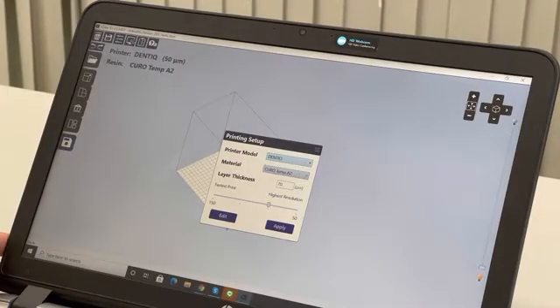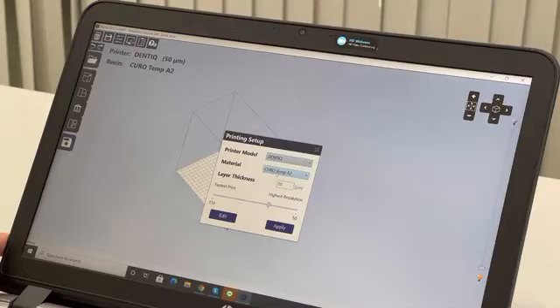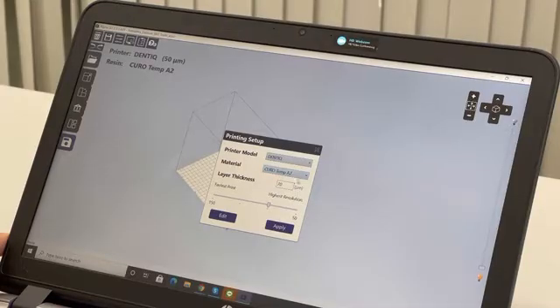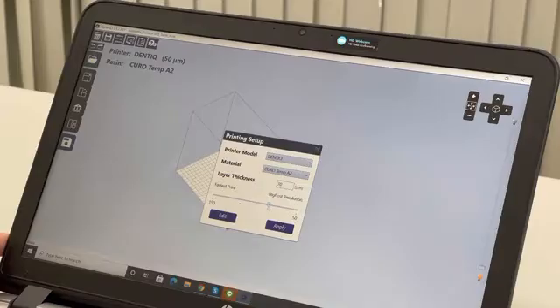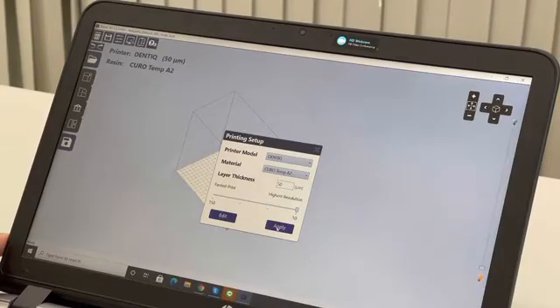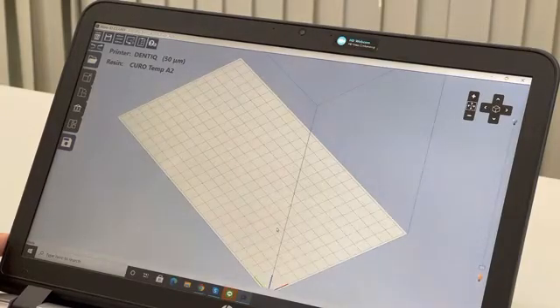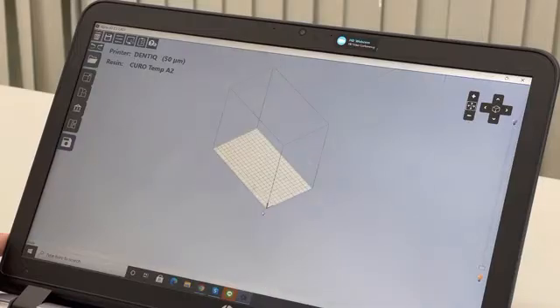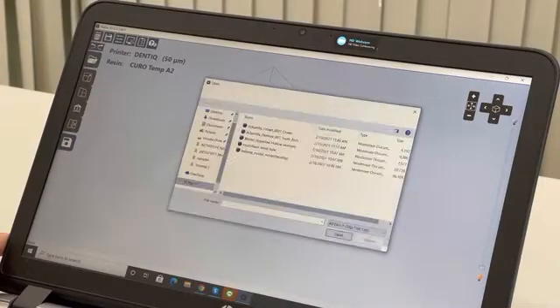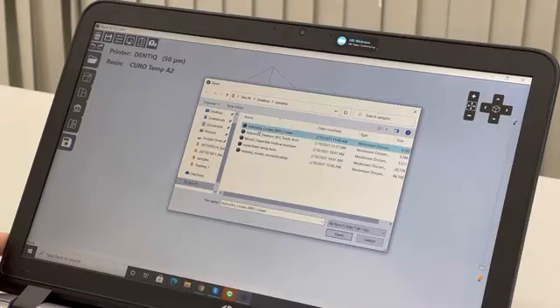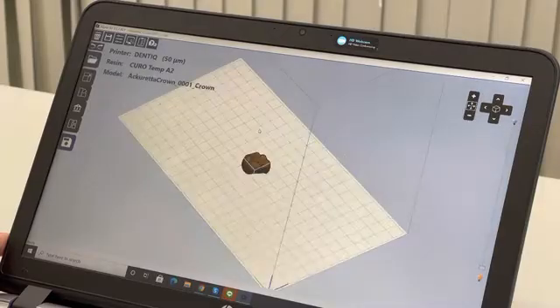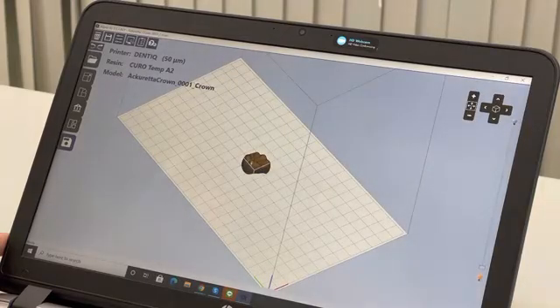We use DENTIQ and we're going to use CURO Temp A2 for crowns and bridges. For the resolution, I prefer to choose 50 since it's a delicate application. Now we can upload the file. First, let's take a crown.